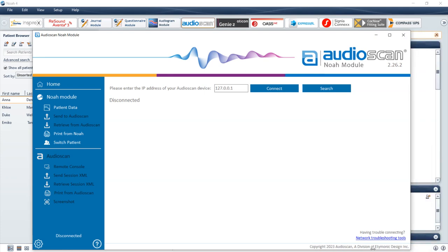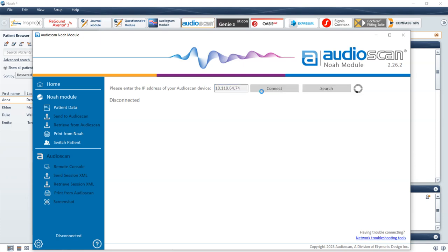Or adjust the size to your preference. If you are using the AudioScan NOAA module for the first time, or need to set up the module, select the Home tab. First enter the IP address of the AudioScan equipment in the hostname/IP address field, and then select the Connect button.